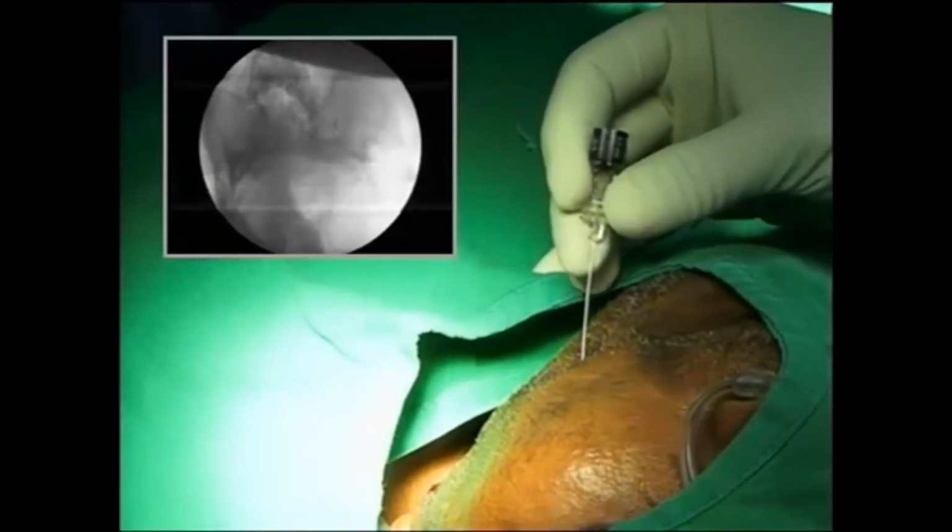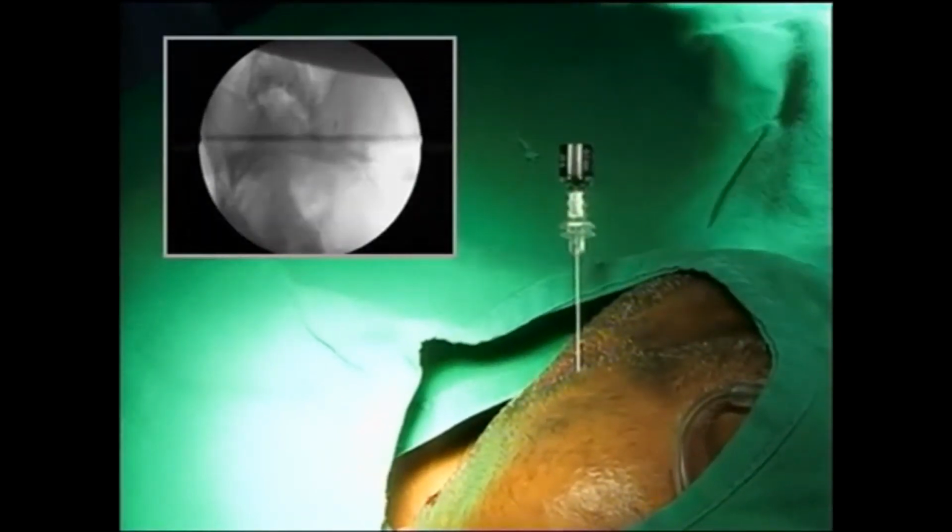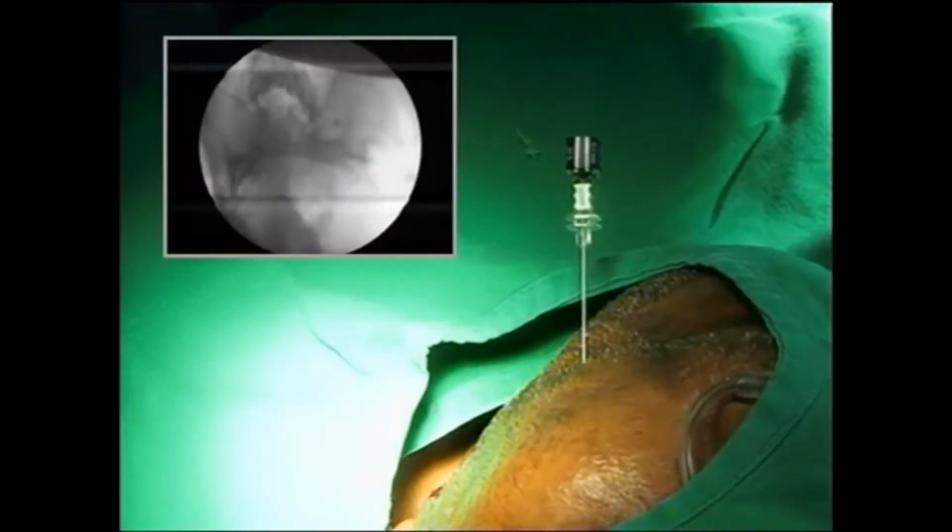Just going to walk into the foramen ovale now. He's having some discomfort. Shoot. Can you see my needle? Yes.